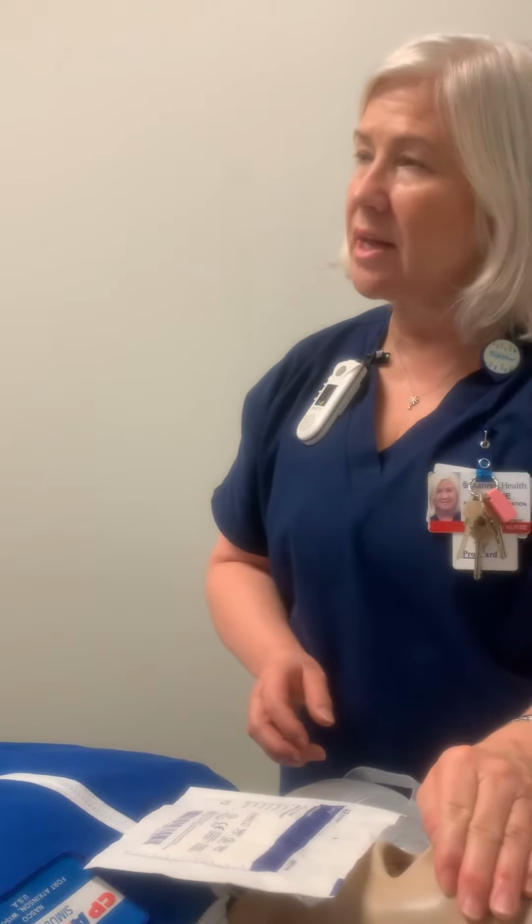So the first thing you want to do is just cover with a 4x4 and you can ventilate here. In the event you're not able to really ventilate well up here, you still have your stoma. But you have to use a pediatric mask, so y'all need to get one. Okay, so it'll be one of your top priorities to do that. Because if you have SWAT who will do it for you, they're going to ask for a pediatric mask. Does that make sense? Is that clear as mud?